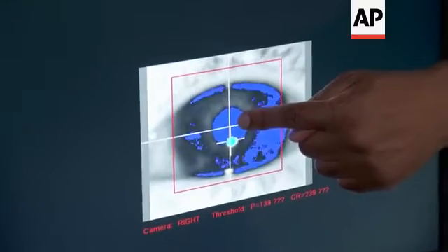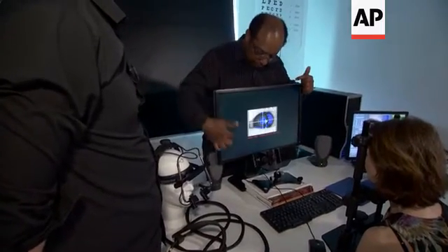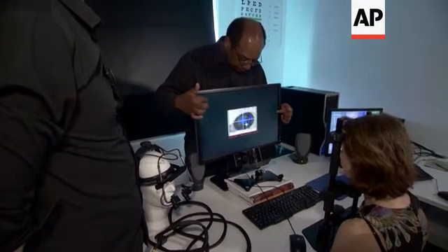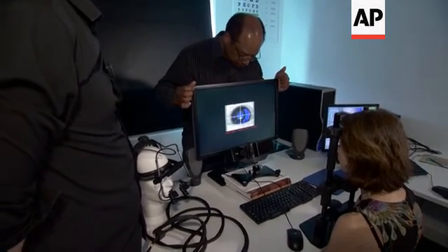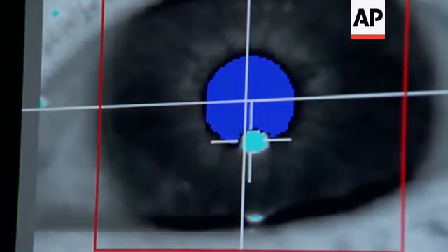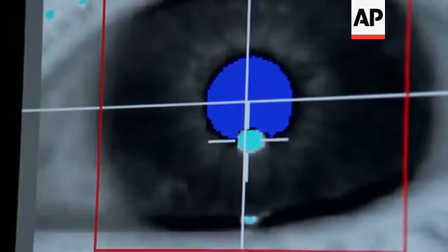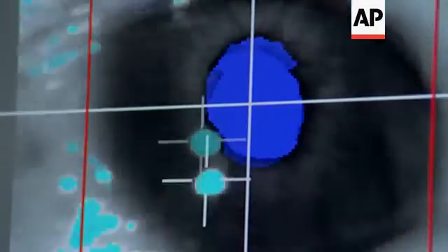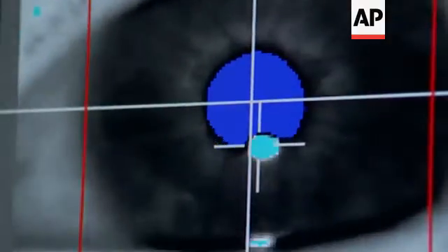Every second it's sampling your eye and then it's doing a geometrical mathematical calculation to work out exactly where you're looking, and it's doing this at incredibly fast speeds so this is all happening in real time. Look to the centre — very good, excellent. Maybe you could look around the screen a little bit, and we could do that again with me zooming out as well if you want.